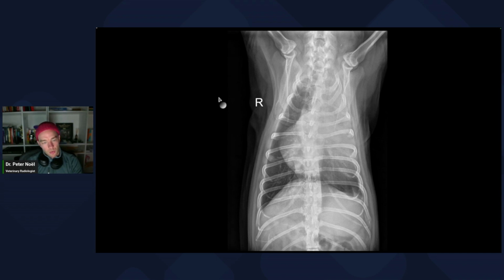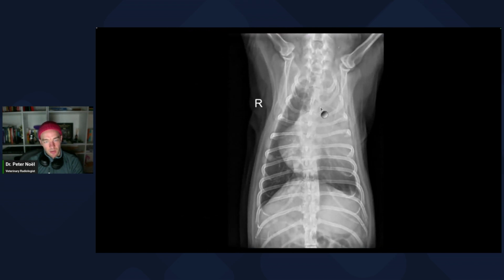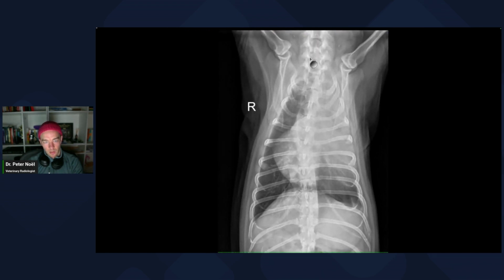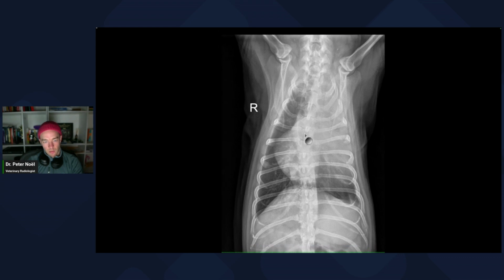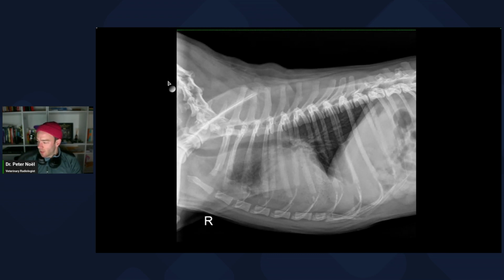The trachea is tortuous. It undulates a little bit, but it's a normal diameter for this breed. I don't think that it's collapsed. This is the trachea right here, if you hallucinate with me. And it normally has a gentle rightward bend, so I feel like that's totally fine. So acute lung lobe torsion, thoracic CT is ideal, just to be sure. If this was a necrotic lung lobe, to give you a little bit of the pleural fluid and vesicular component and not torsed, I still think it's probably best, or there needs to be a discussion about why it's necrotic, and it probably needs to come out anyway.